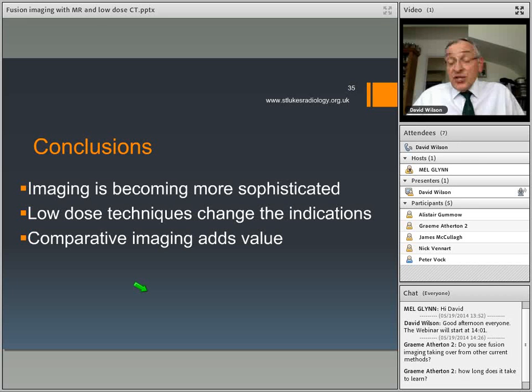So there's a learning curve in getting the fusion set up and getting the images linked together. It does certainly take longer than a conventional ultrasound examination. You're going to add about another 5 to 10 minutes, and with the pressures of the NHS, maybe you won't want to spend that time. But if you've got that time and you've got the luxury of it, or you've got some complicated procedure that you want to do, then I think it will pay off for both you and the patient.